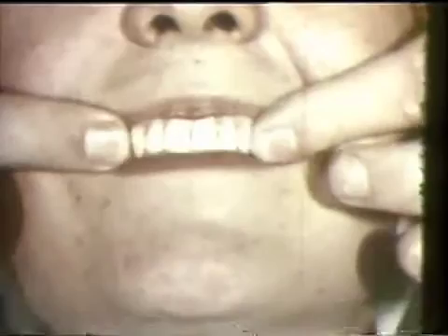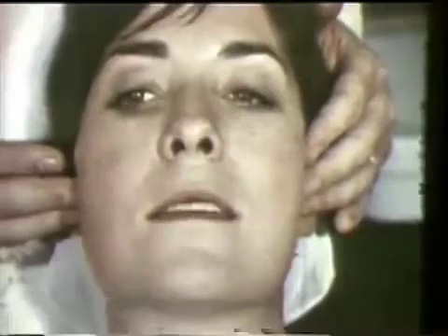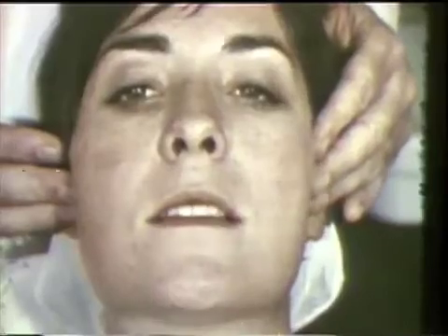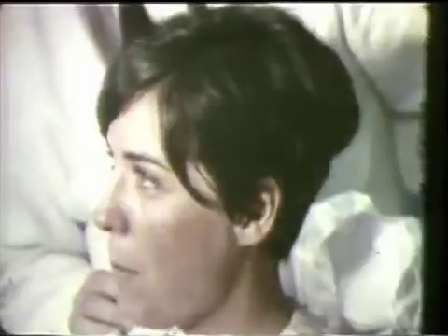The teeth are palpated to test for lateral impact when they are tapped together firmly. A final test for smoothness of all eccentric movements is done with a hand on the patient's chin. The temporomandibular joint is also tested. The centric and eccentric occlusal contacts and chewing patterns are tested with the patient sitting upright. The patient should be able to chew with equal ease on both sides.